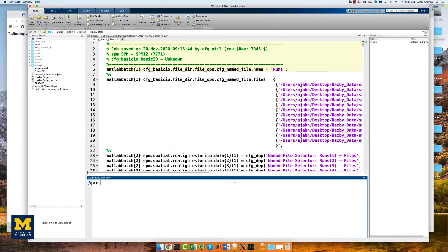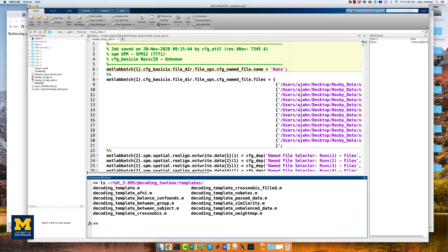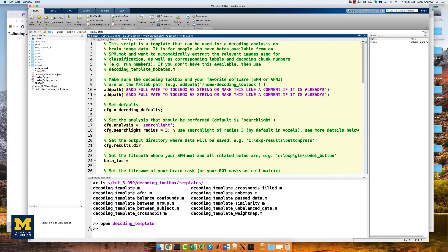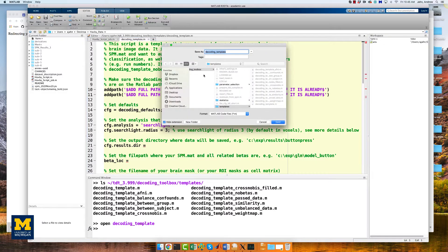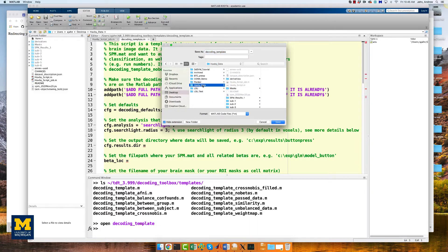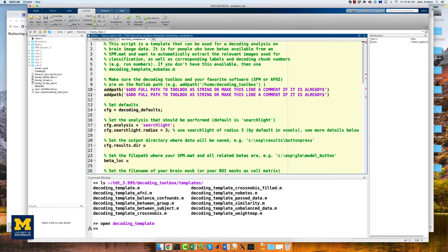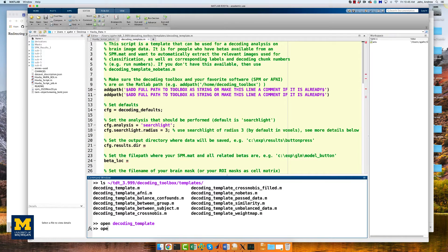The Decoding Toolbox contains many template scripts, which you can find in the TDT folder under Decoding Toolbox > Templates. For now, you will only need to modify one script: decoding_template.m. Open this file by typing 'open decoding_template' from the command line, which will display the file in the editor window. Using the editor tab, click Save > Save Copy As, and save it to the folder Haxby Data on your desktop, labeling it Haxby_MVPA_ROI. Then open this newly saved script from the command line by typing 'open Haxby_MVPA_ROI'.